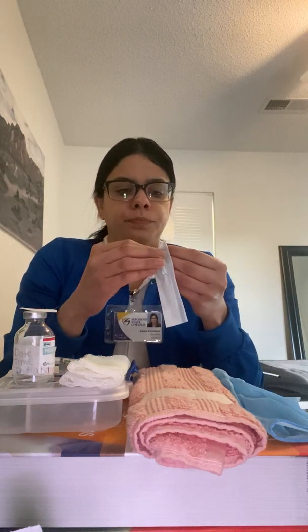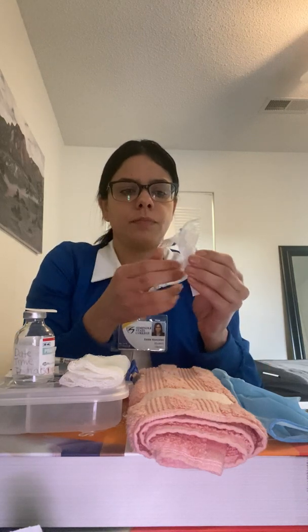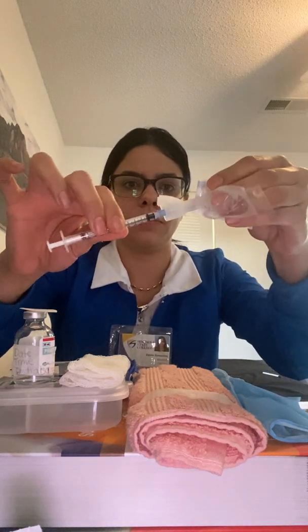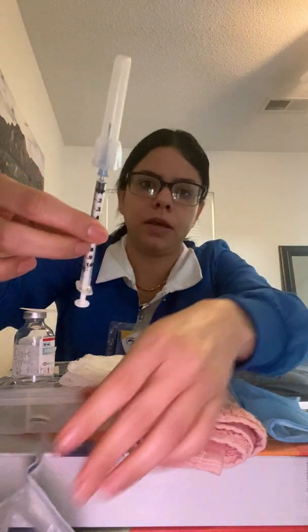Now what I'm going to do is I am going to open my needle and my syringe. I'm opening, and I am going to insert my syringe into the needle right there. Okay, and there you go. I have my needle.